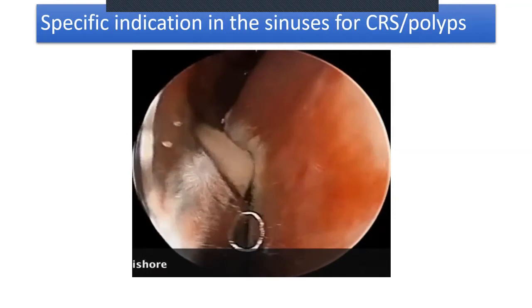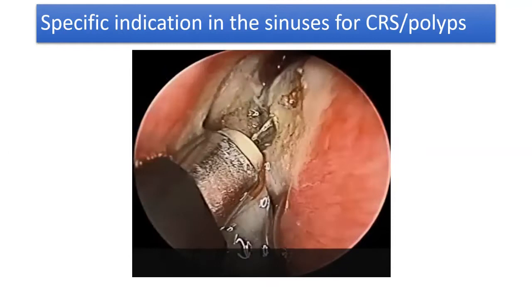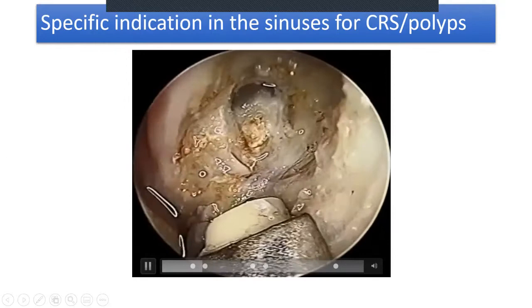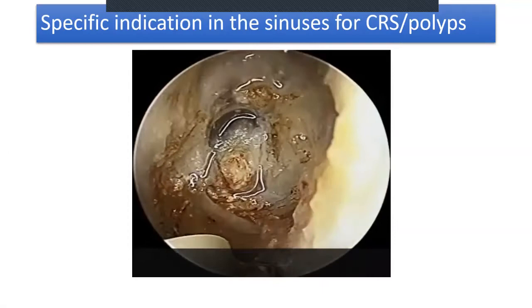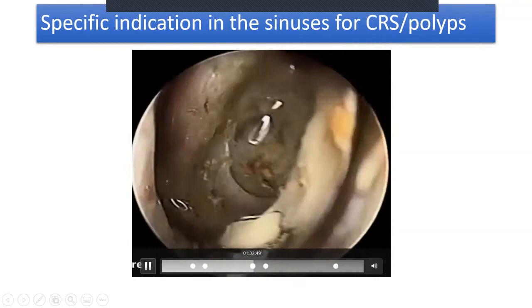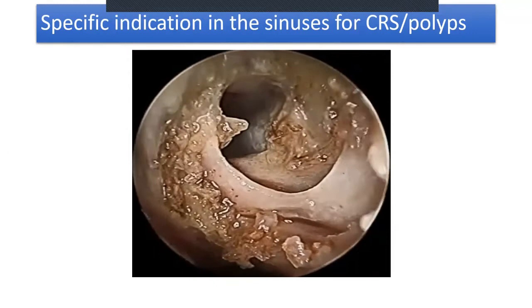This tool can irrigate, coagulate, and ablate — you can see the sphenoid ostium beautifully and ablate the polyp fiber by fiber. Then using mushroom forceps to clear it off, you can see exactly where it was coming from — not a drop of blood.